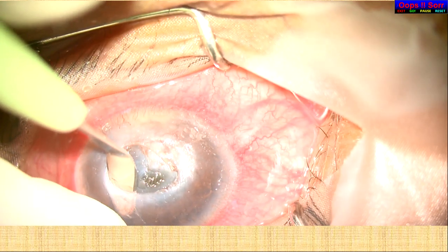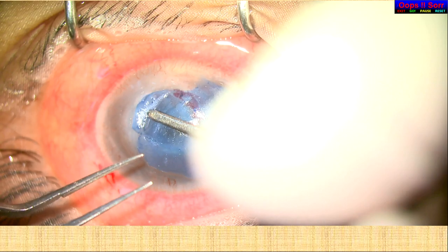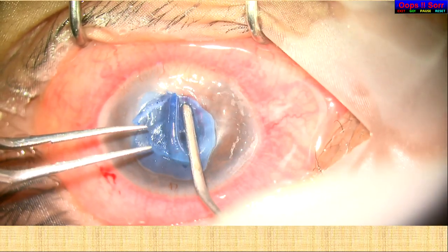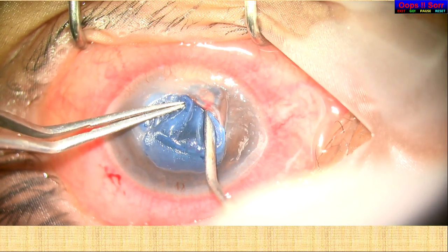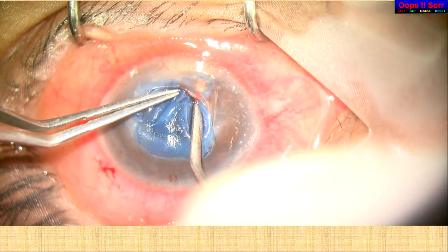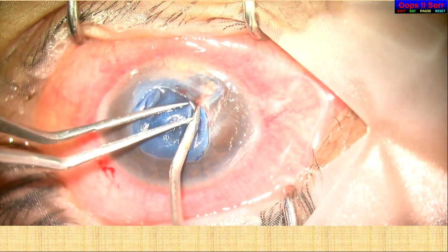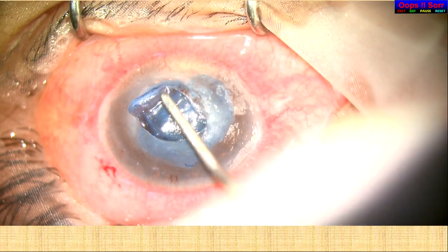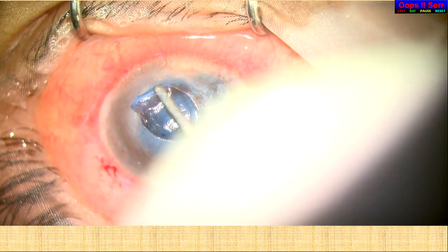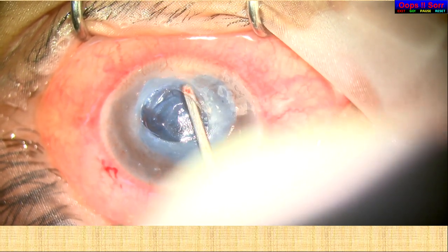Sutures are not required, no glue is required, just tuck in this lenticule. This surface is very smooth, so the epithelium naturally comes over this Bowman's. After this tuck in, we put a BCL over it. The surgery is over.